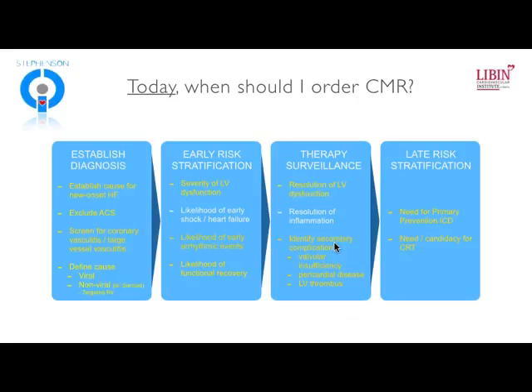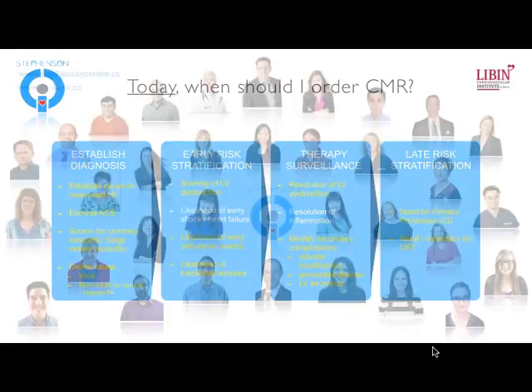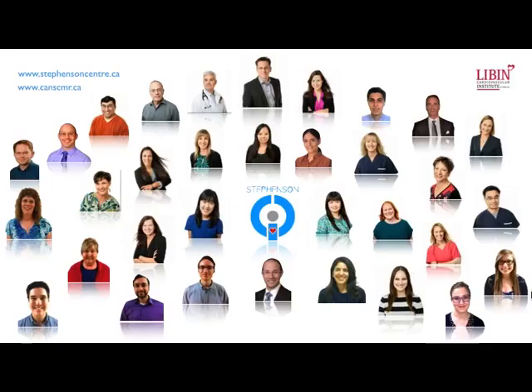Certainly, it's of value for potential surveillance, and I think that with the addition of T1 mapping, being able to identify resolution of inflammation, it may emerge and may be able to identify people that shift into a chronic inflammatory state where they don't have complete suppression, and that might bring across some new potential for intervention, such as treating those people with immune modulating therapy. And then finally, obviously, there's going to be an ongoing need to identify patients that are at risk of future arrhythmic events for ICD, and also appropriate management or planning of CRT.